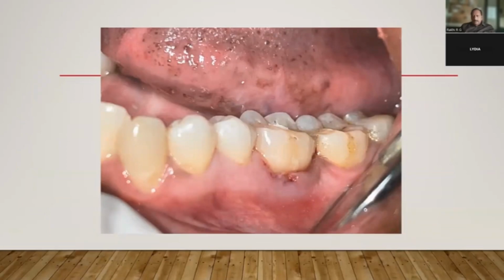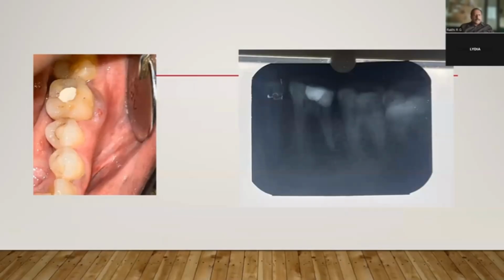So there was this after draining it. Show the previous one. So there was a pointing abscess. A pointing abscess, that's what it's called. So there was a periodontal abscess, which has already extended to the soft tissue area, and it was pointing towards the external area. That means there is a considerable amount of bone loss already there.